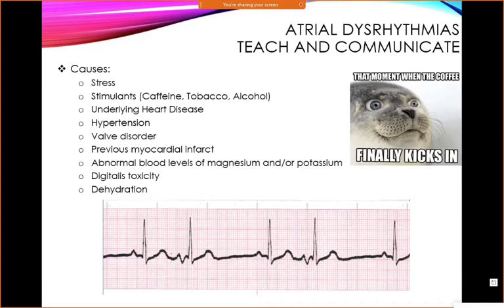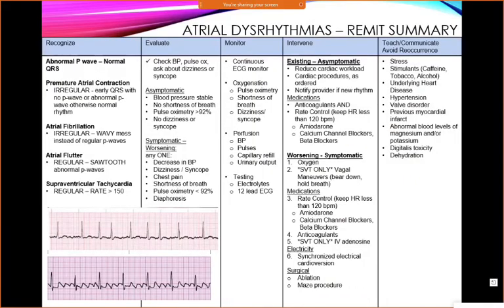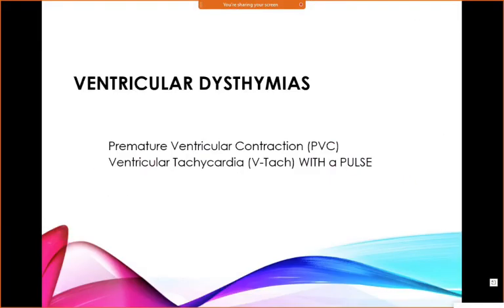Many causes of atrial dysrhythmias. Again, I don't like that rhythm. I'm going to get rid of that rhythm. Ventricular rhythms. The thing to remember about ventricular rhythms is they usually don't have any P waves, and they have a wide, weird QRS.